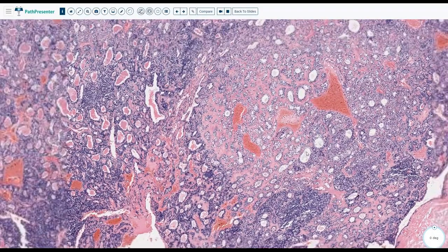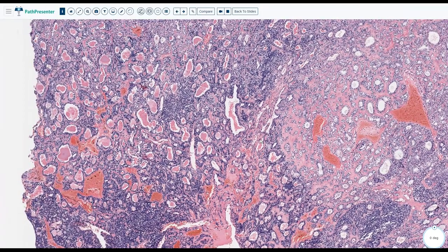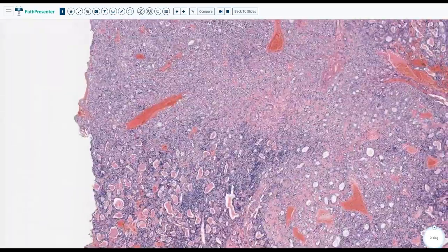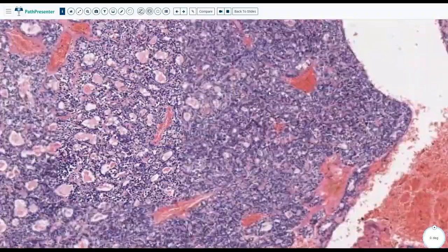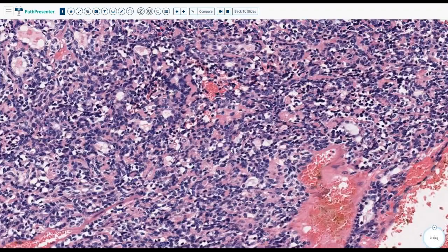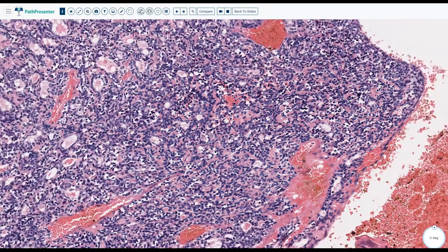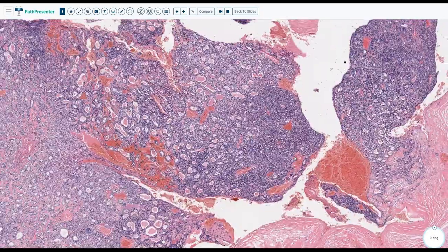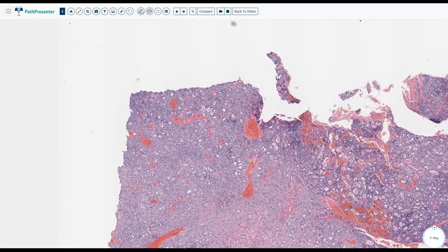Does that mean that if you just call it myoepithelioma, you are completely wrong? No, some areas will be very heavily myoepithelial, like here. Maybe if you have a core biopsy from here, that's what you're going to call it. Almost similar prognosis. Just keep clear margins, and the patient probably won't see him or her again. Okay.